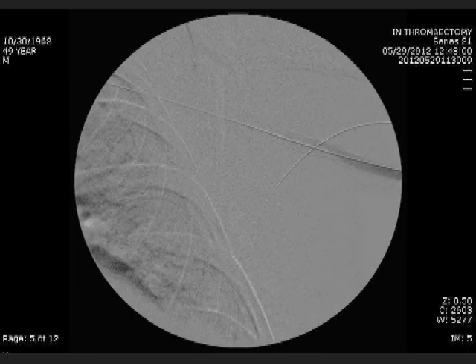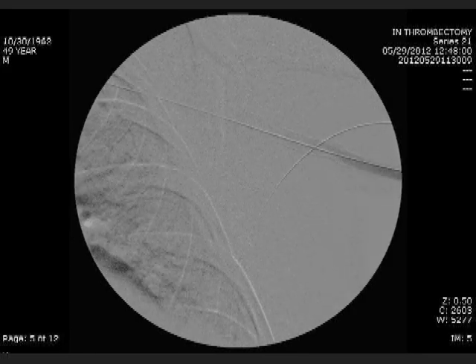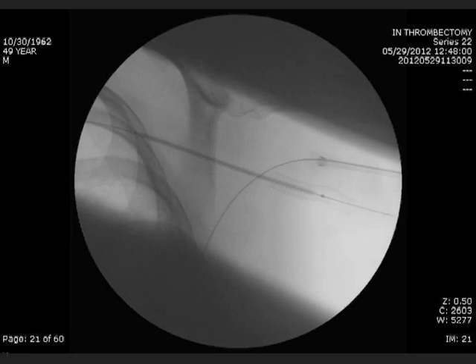As you can see, post-angioplasty, there is recurrent elastic stenosis at the proximal end of his existing stent. I chose a 9 mm by 10 cm heparin-coated Viabahn stent graft. As you can see, the stent begins to migrate proximally before it's fully deployed. I pulled back on the stent catheter to try to reposition the stent. However, the stent dislodged from the catheter and migrated proximally.